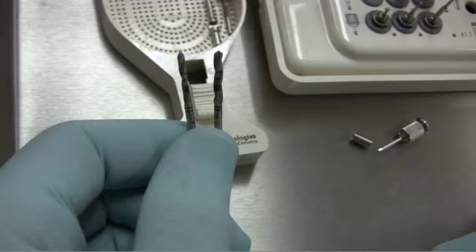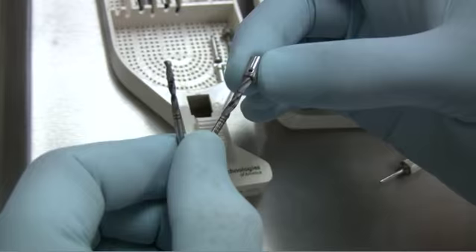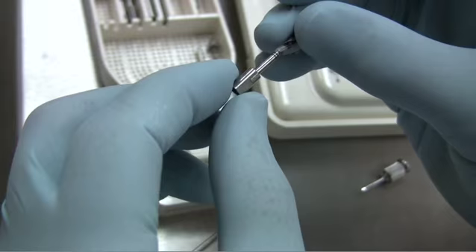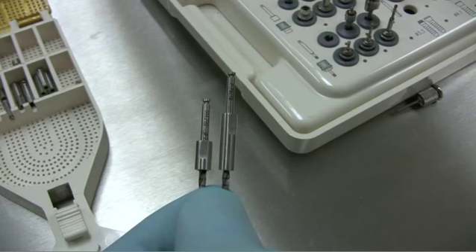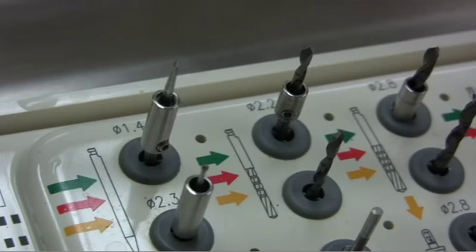As you can see, the 2.8 drill can only be inserted from one end of the stop. The patented internal bore allows the stop to be interchangeable with different drill diameters. This shows a 10mm stop sliding down the shank and stopping at the 10mm marking. The stop is prevented from going past the 10mm mark by the cutting flutes of the drill. The stops are available for both long and short drills. I plan on placing a 4.1 by 10mm implant with a surgical guide, and to reduce surgical time, the stops are pre-set on my drills.